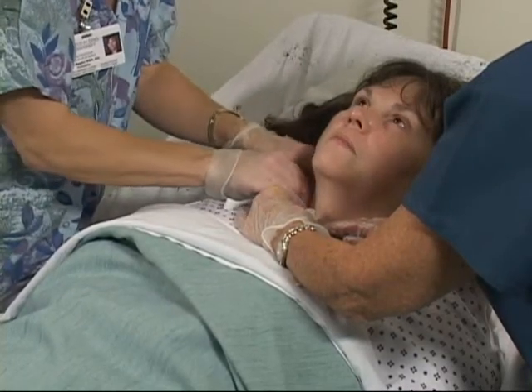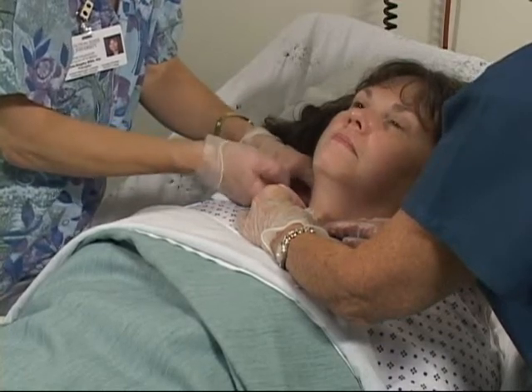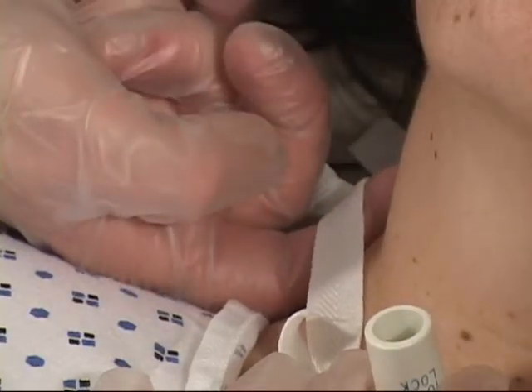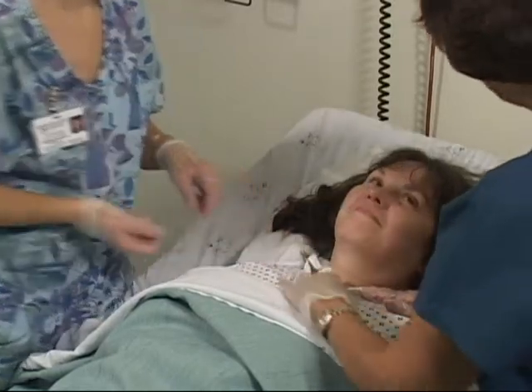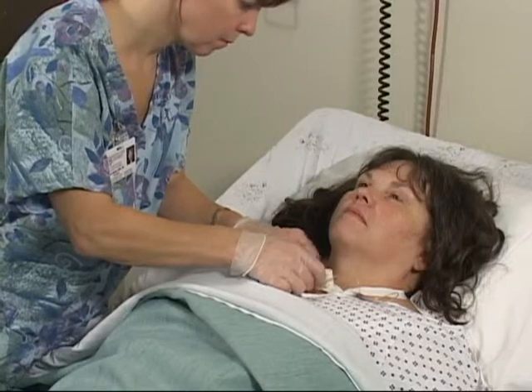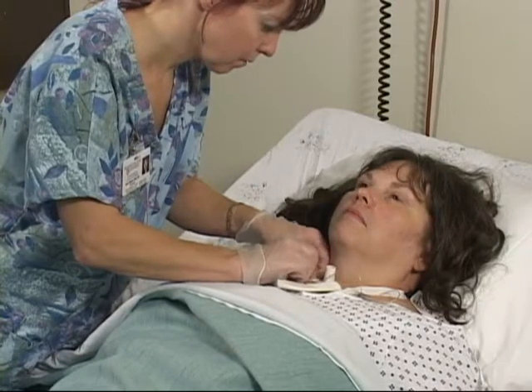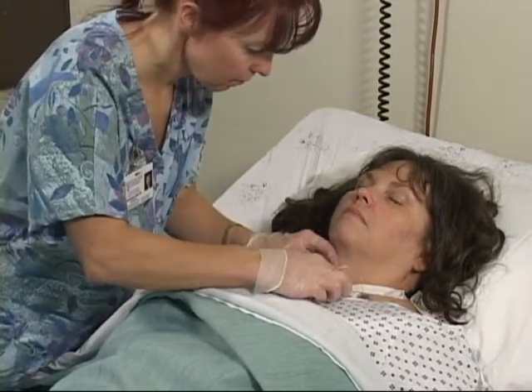Then tie the tracheostomy tapes with a double knot at the side of the neck to avoid any pressure source at the back of the neck. These tapes need to be snug enough to hold the tracheostomy tube in place while allowing one finger beneath the tape for neck movement. The second person can leave now and wash hands. There is a split gauze in the cleaning kit that will slide under the neck plate of the tube to provide a cushion for the skin and absorb secretions. Discard all used materials and wash your hands.